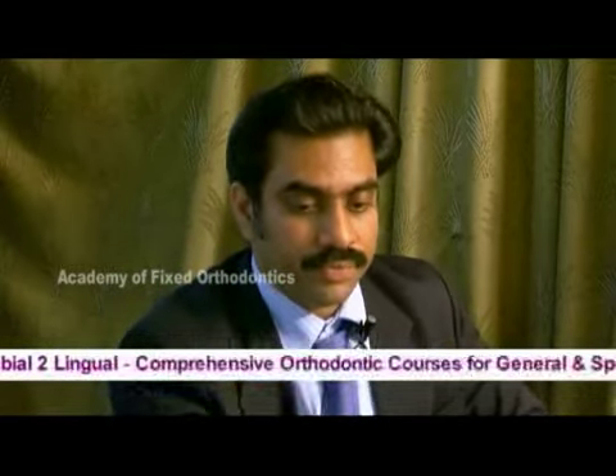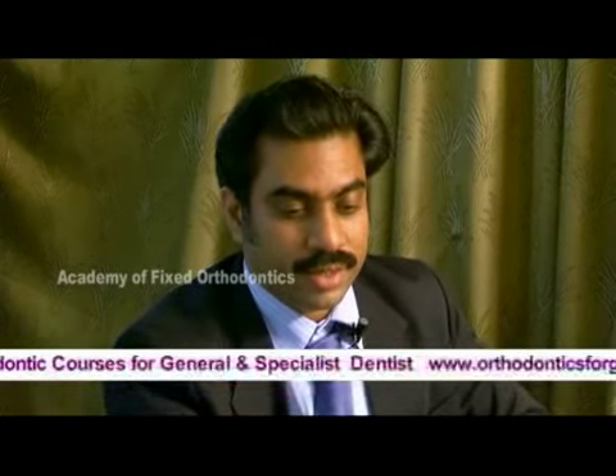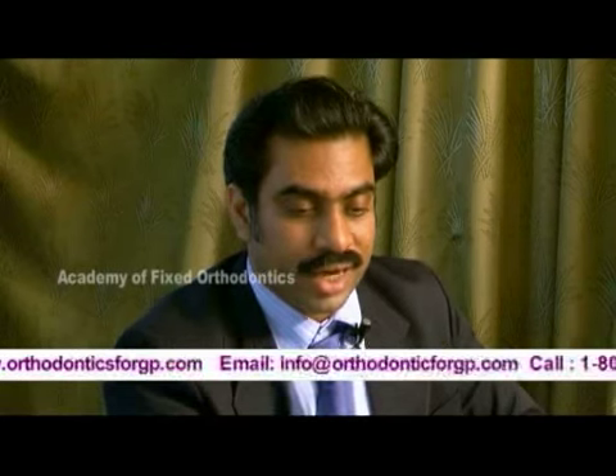There is a Boon's gauge — you can see the measurements here. The flat part is kept on the incisal edges and the pointer is used to mark the height.